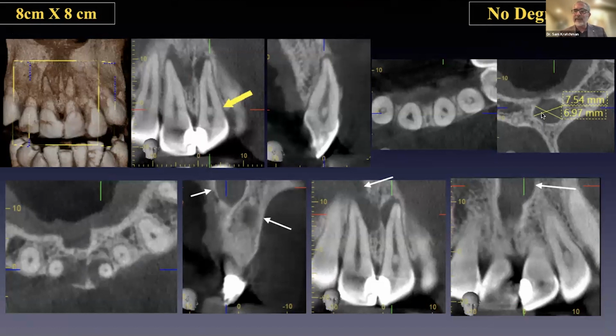And then what I typically do here is I like to measure the size of the lesion. My cutoff, if I'm going to do apical surgery, is usually if lesions are around 7 millimeters in diameter, it's not going to heal spontaneously from conventional root canal. So I have to warn the patient that there's maybe a good chance of doing surgery in the future.